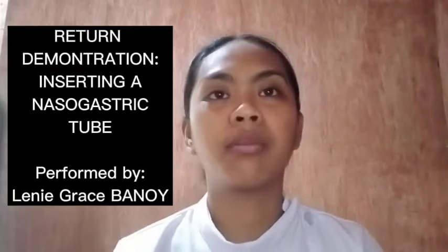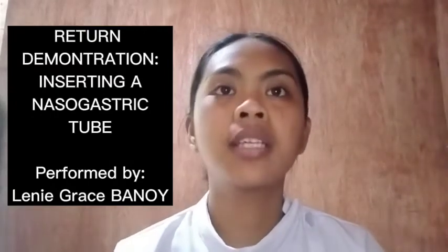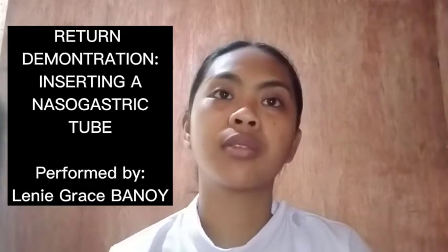Good day, ma'am. I am Lenny Grace Mbane from the SN3B. Today I'm going to perform inserting nasogastric tube.